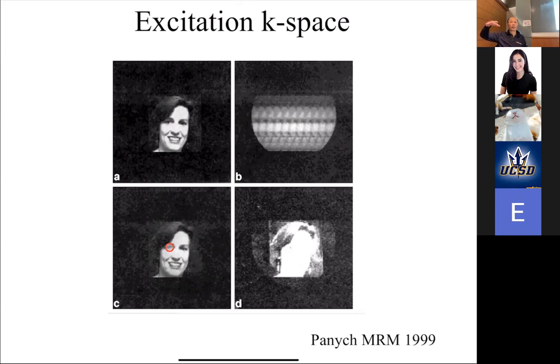Okay. So it's sort of interesting because this isn't like post-processing, right? This isn't like you're making some pseudo image. It's actually, you are making the magnetization do exactly what you want it to do. Okay.